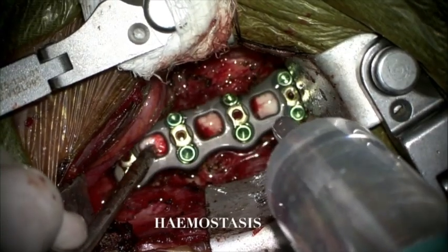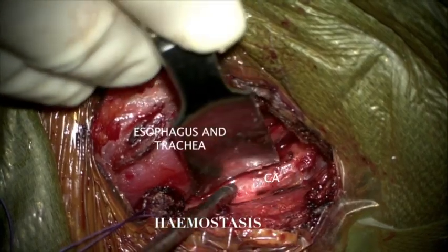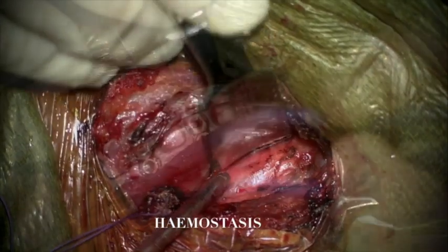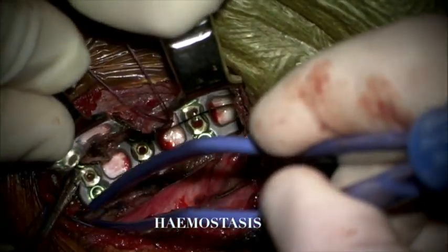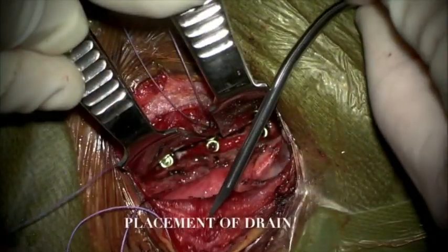Irrigation with copious amounts of antibiotic saline was performed. Any bleeding was easily controlled by bipolar coagulation and gel foam powder. We then inspected the jugular vein and the internal carotid artery on the left side, as well as the medial wall of the esophagus.